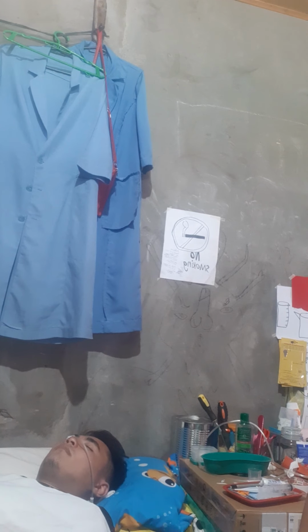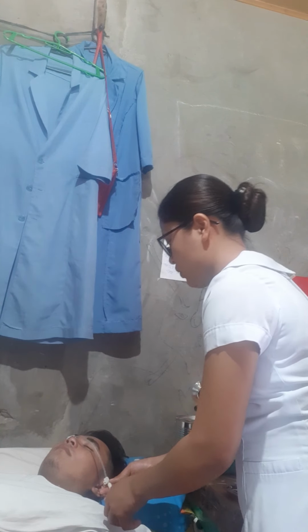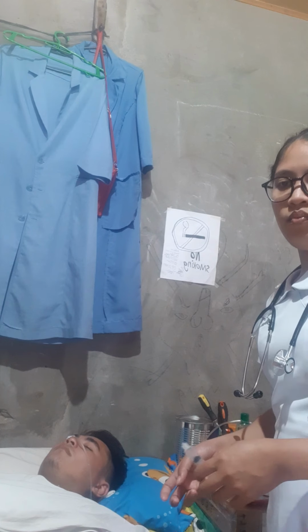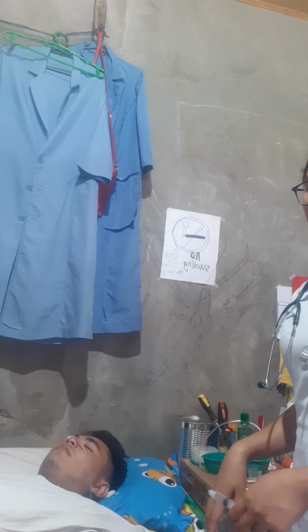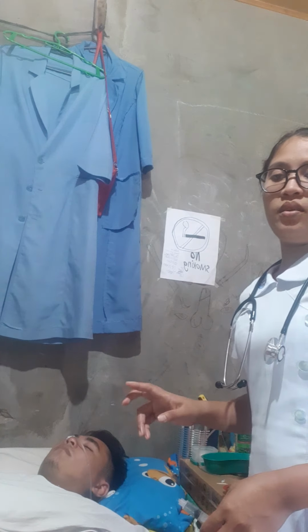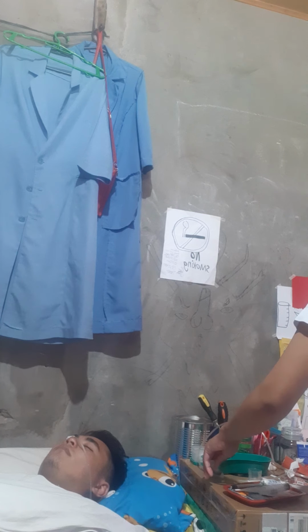Then next, assess the tube placement. Afterwards, I attach the syringe to the open end of the tube and aspirate. After aspirating, we are going to test it, but before that, we allow 1 hour to test the pH if the client received medications. But if not, we just test directly.